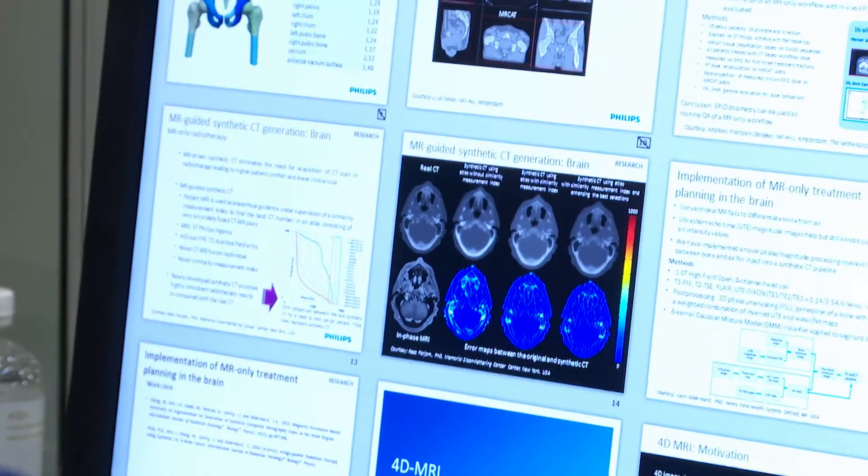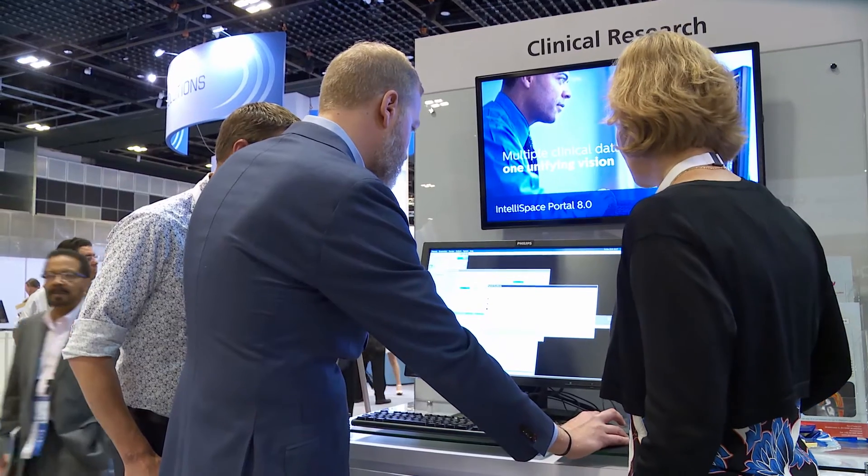ScanWise is a unique guided user interface and automatic parameter selection that simplifies scanning patients with MR conditional implants. Once a technologist has identified the MR conditional parameters of an implant, ScanWise implant allows him to enter these parameters and the advanced technology behind it will automatically adjust all scan parameters of the complete examination, so the MR technologist can be confident that the examination does not exceed the limits of the implant.